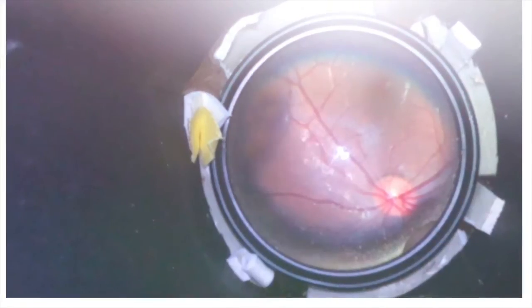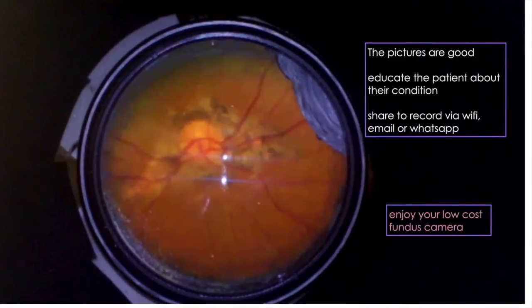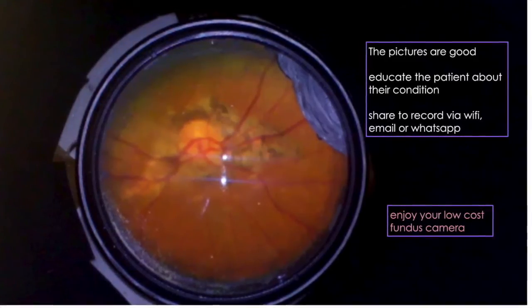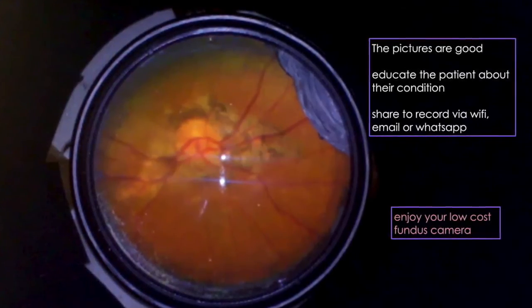The device is used like any other indirect ophthalmoscope. The quality of the pictures is reasonably good — we can educate patients about their condition, and if necessary we can share the image by WhatsApp, by email, or by WiFi.